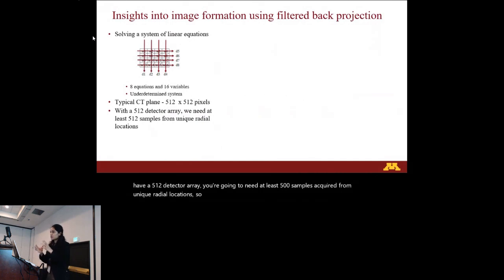So that's basically what underlies computed tomography, wherein you acquire a lot of attenuation samples at different radiation angles and essentially solve a system of linear equations. It's not going to be possible for a human to do, and a computer does it, and hence the word computed tomography.